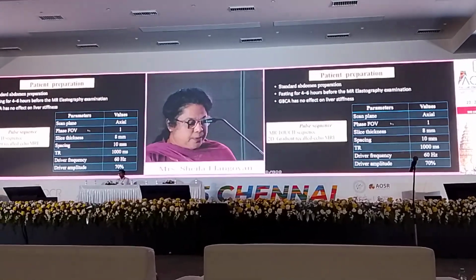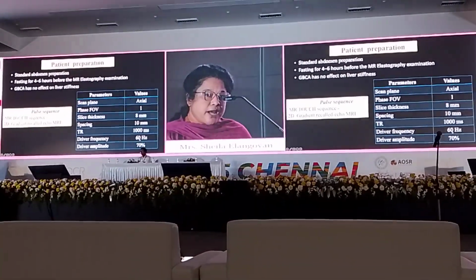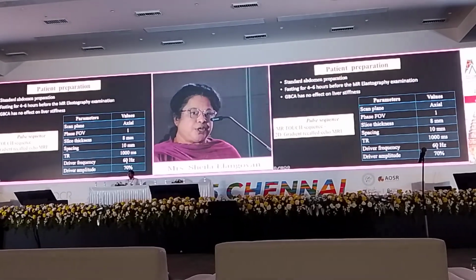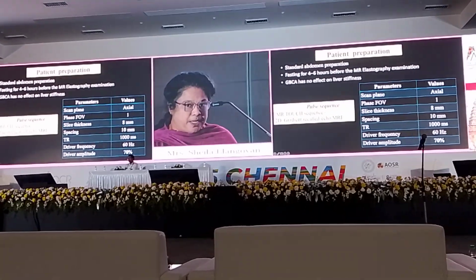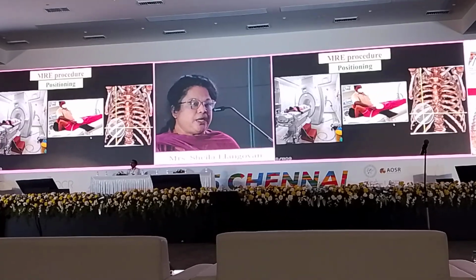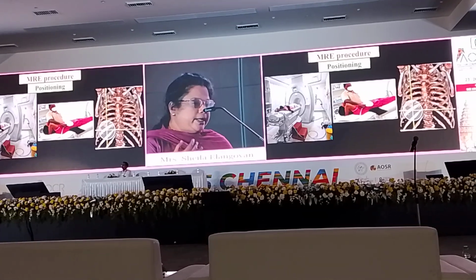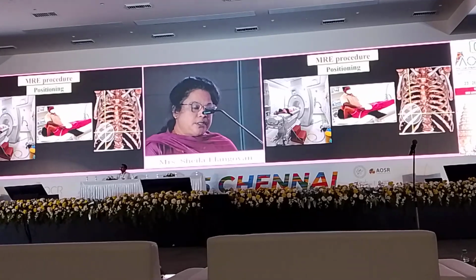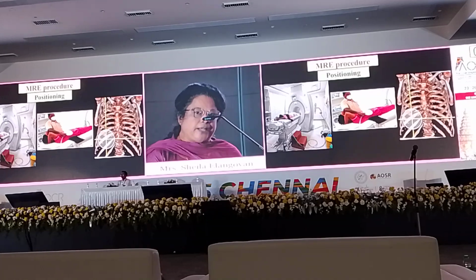So this is a pulse sequence. The parameter that you need to really look into is your driver frequency. On a standard across all equipments across the world, it is 60 Hertz, because for reproducibility and for validation purposes, it's always 60 Hertz. The driver amplitude is 70%. Of course, that is a little variable between 70 to 100%. Okay, now the patient has to be in fasting. Actually they say that in a patient with normal liver, the food intake does not alter the liver stiffness measurements. But in patients with fibrosis, they said that immediately after meal, there can be changes in the liver stiffness measurements. So better to insist on fasting.